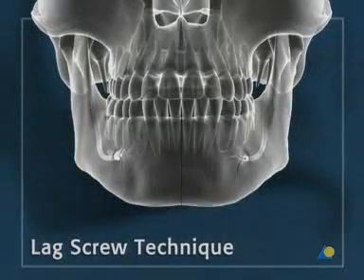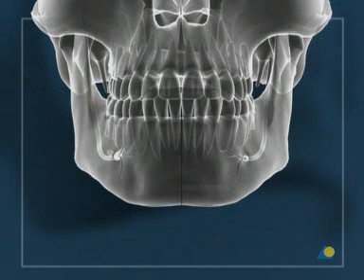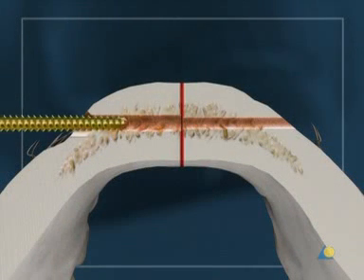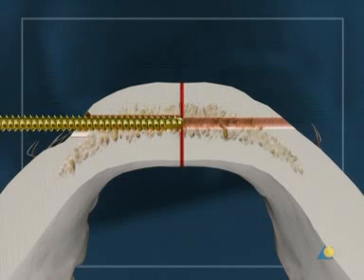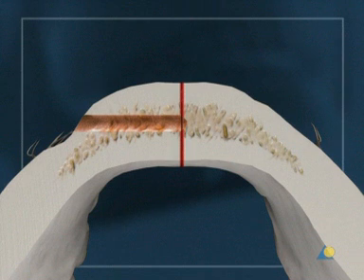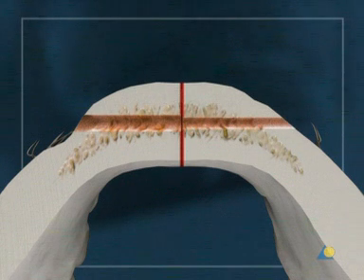The mechanism of a lag screw is now illustrated. One screw is placed at the inferior border. To achieve interfragmentary compression, the hole in the near cortex must allow the screw to glide axially. To assure this movement, the near cortex is over-drilled with the 2.4 mm drill bit. Then, using a long 1.8 mm drill bit, drilling is continued through the far cortex.